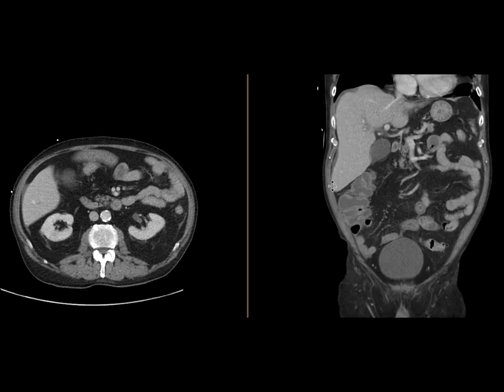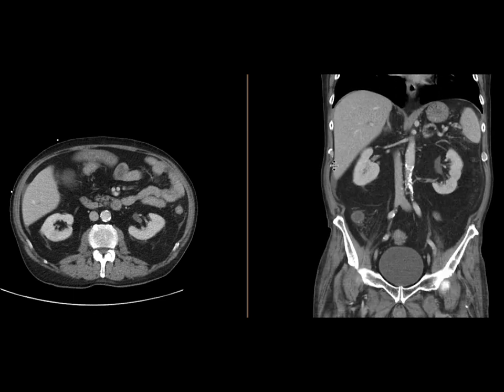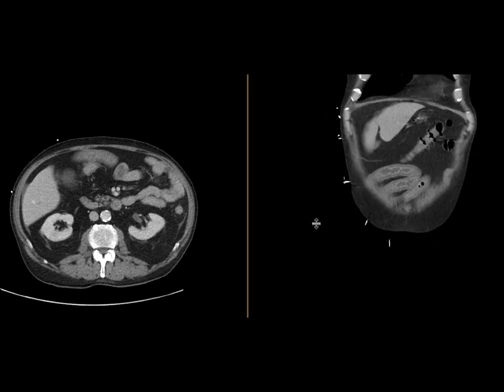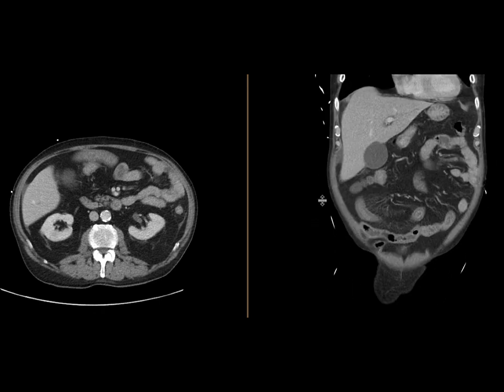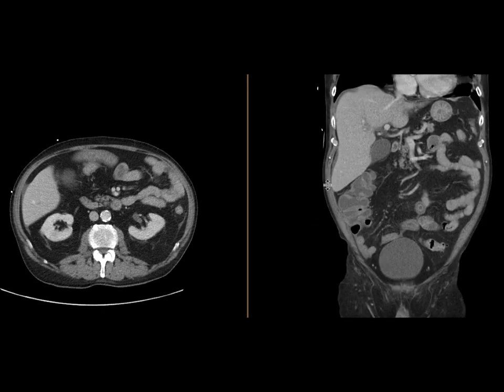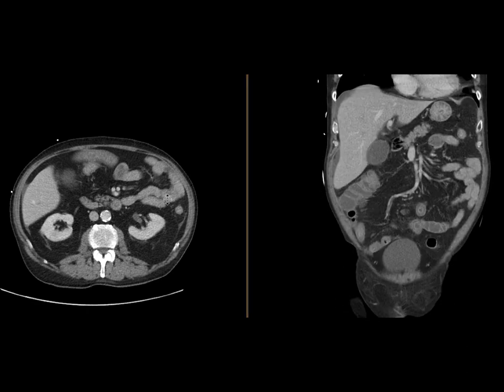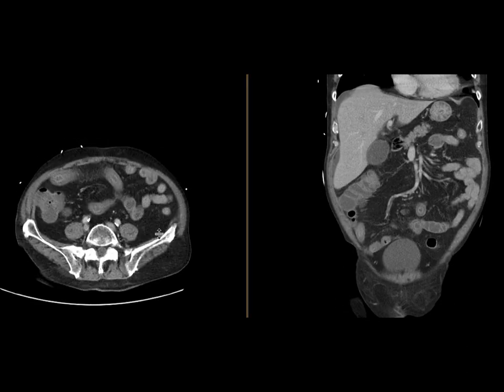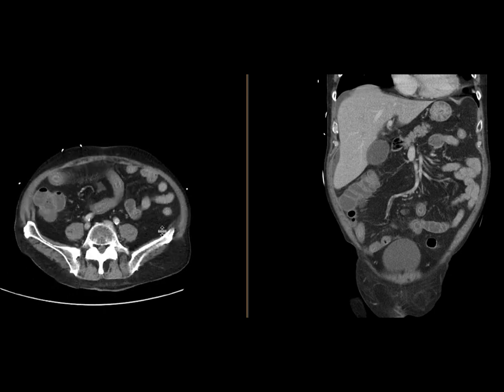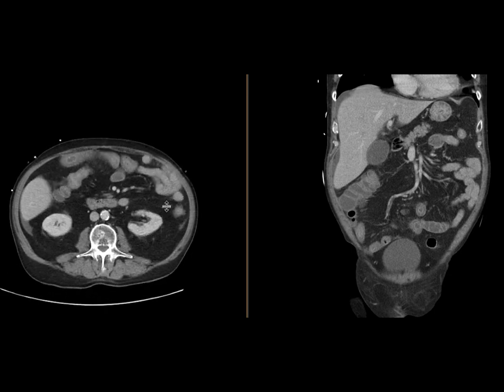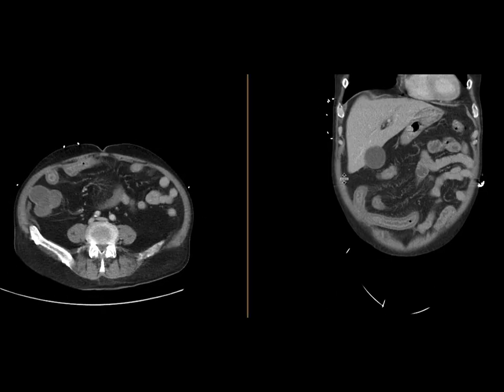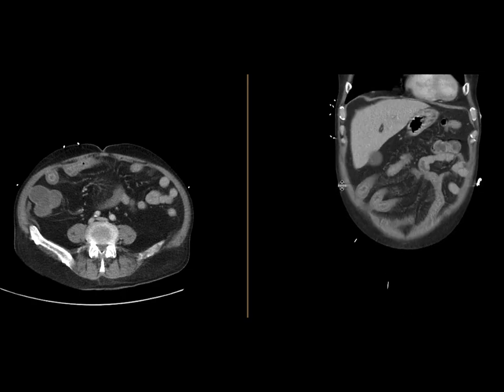There is additional history which was withheld: this patient has a history of myelodysplastic syndrome and had received a stem cell transplant. In that context, one of the other etiologies of these findings may be small bowel graft versus host disease, which can give this appearance. A biopsy was done, and this indeed turned out to be graft versus host disease in the small bowel.